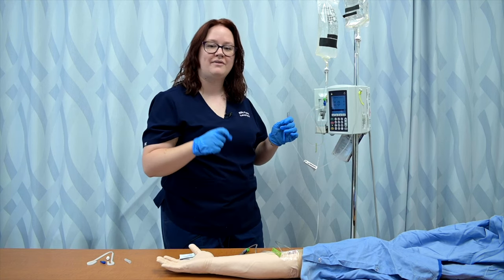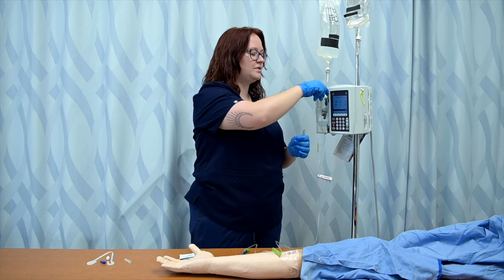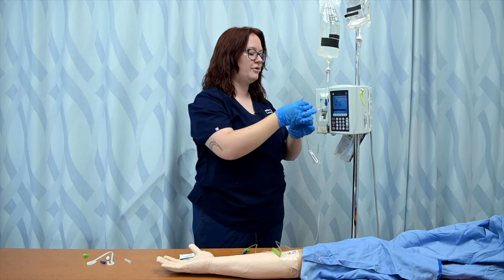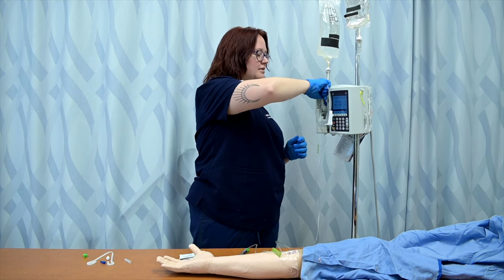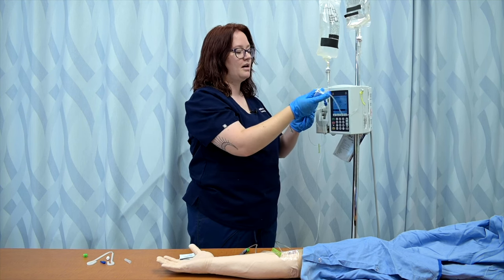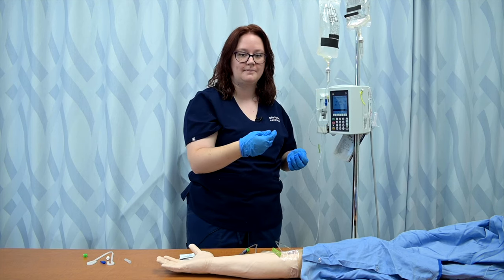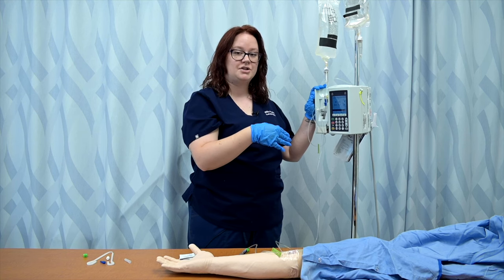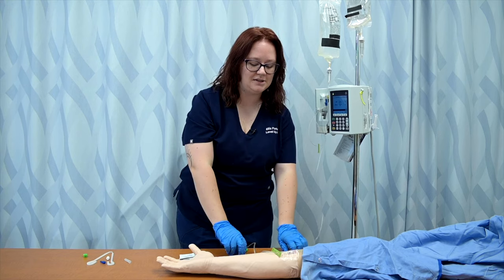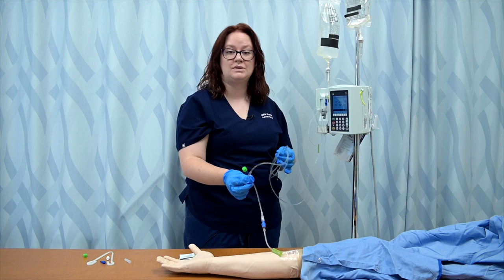Now my pump's got one of those disinfectant protective caps on the port, but your facility may not use these. If you don't have a disinfectant cap, you'll just use an antiseptic swab to clean this port before you attach your secondary line. And then make sure you have unclamped your secondary line. Otherwise, when your pump begins to pull, it will think there's an occlusion and it won't actually run. Make sure that when you attach the secondary line, you are using the port that is above or on the pump.